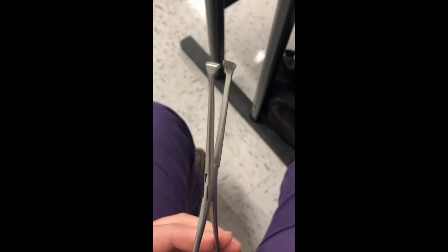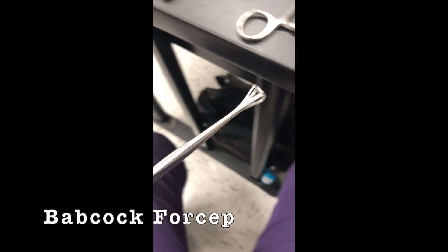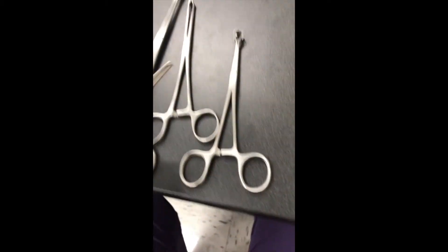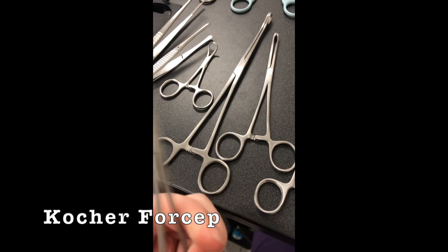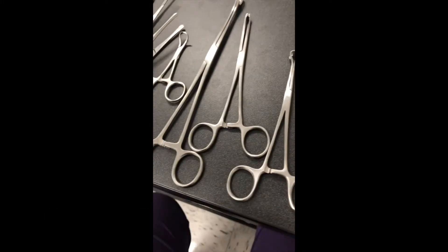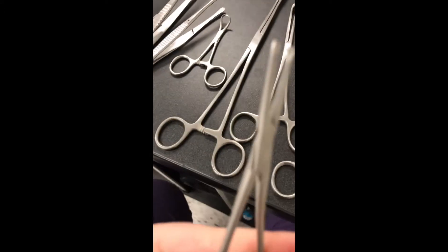Now this one is the Allis. Okay. And then the Babcock. And then this one's the Kocher. Yeah, right? I'm just trying to picture it.